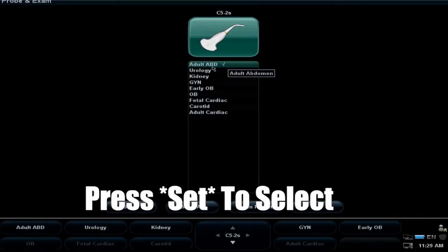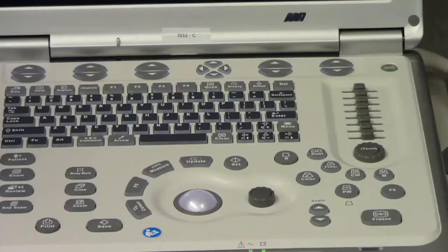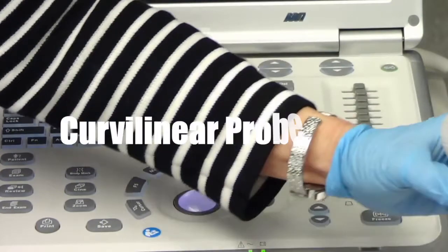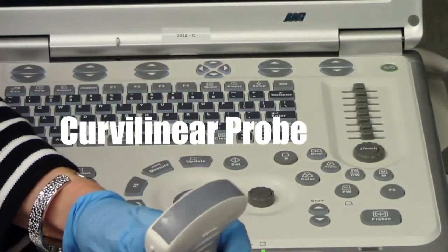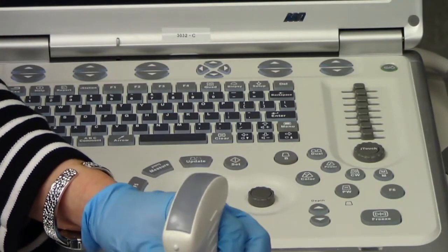You want to press the set button to select it. For your probe selection, you want to be selecting the curvilinear probe. The best images are from this probe.